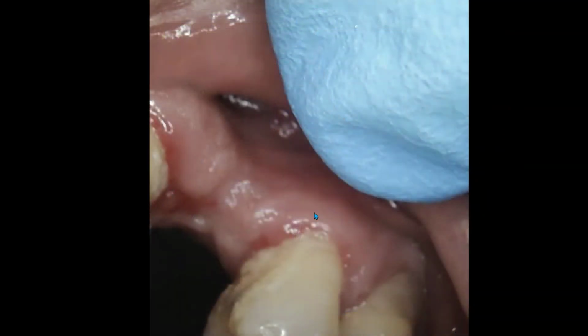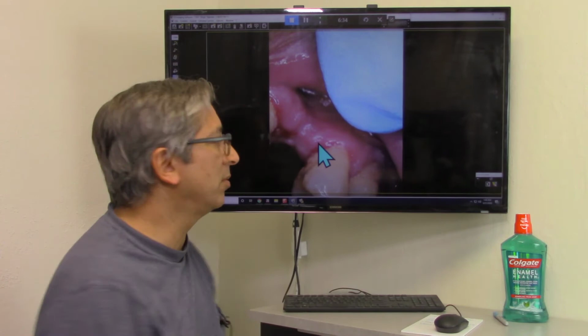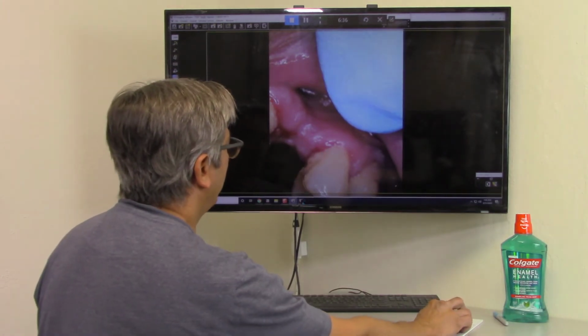Here's how the teeth have natural bone, but the bone is very, very thin on the cheek side here, and here's towards the front of the mouth. That's the canine I was showing you earlier. And the implant goes in here, and you can see that the tooth has to come down and somehow meet into the gums right down here to give it any resemblance of something pseudo-normal. So let's go back to the CT.